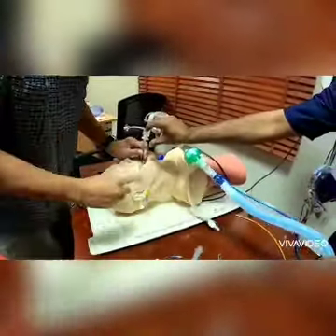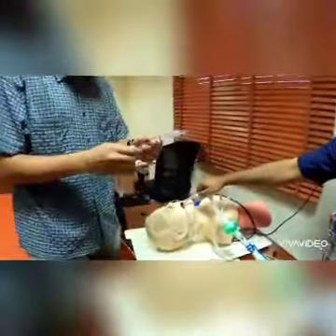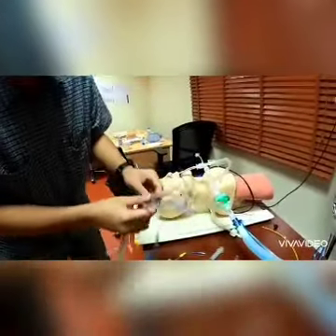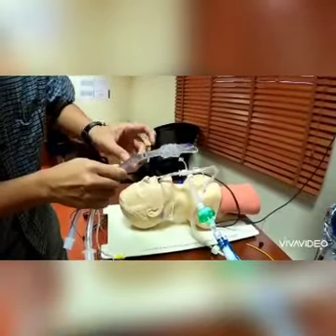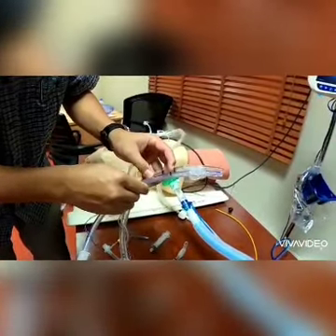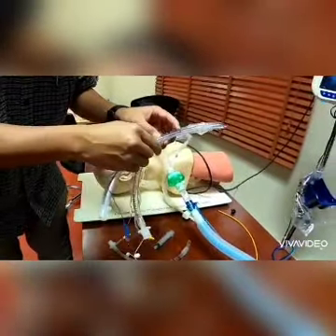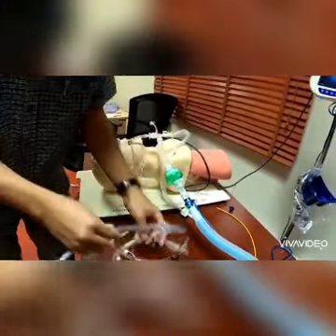If you happen to use the standard ET tube, you will not get two lines, you will only get one line. So if your ET tube has one line, you just need to stop around about the black line, your vocal cord. Okay, don't make it disappear too far, and definitely don't make it too superficial.